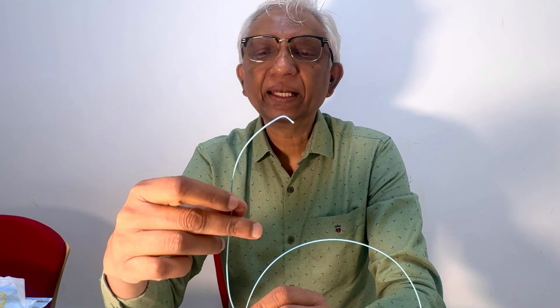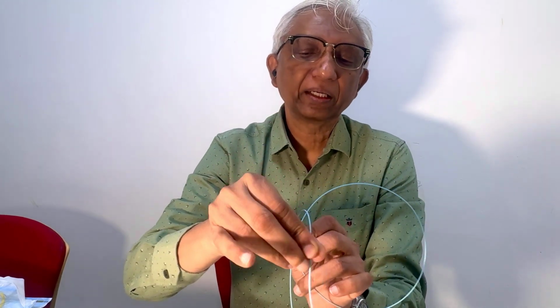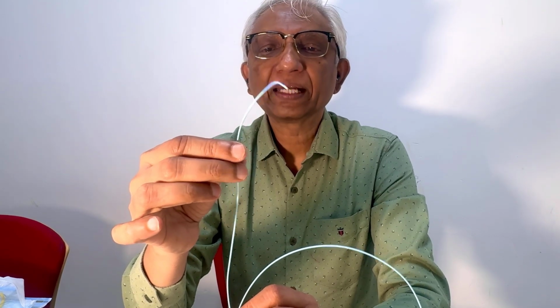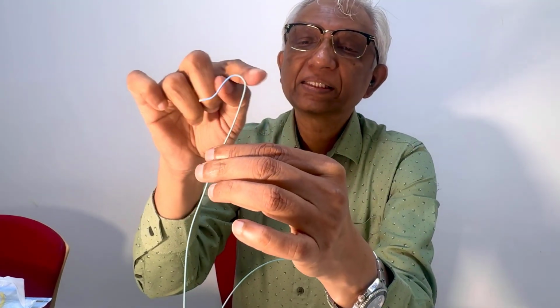So the Judkins right, as you know, was ideally created to enter the right coronary artery. Okay, you come down like this and you go into the arch and you rotate it this way, it will hook. But this also works pretty good as a visceral catheter and can be used very often. But probably one of the catheters we use very often, at least in our department, is the Simmons catheter. The Simmons catheter again is 1, 2, and 3, depending on the secondary curve and the length.